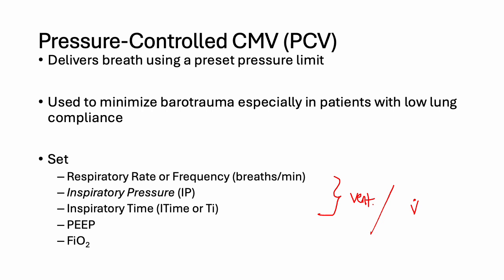The corresponding volume that is measured for this inspiratory pressure becomes the exhaled tidal volume.